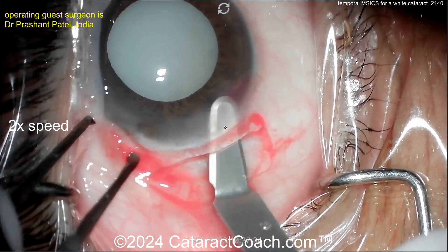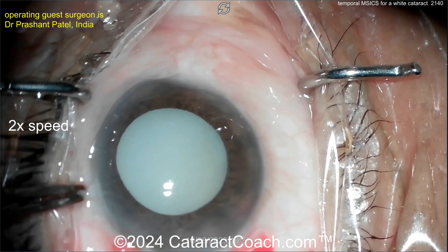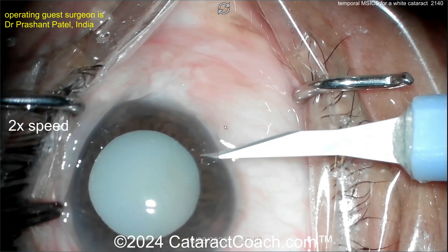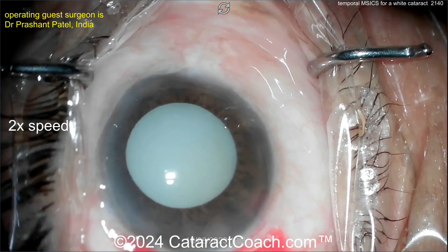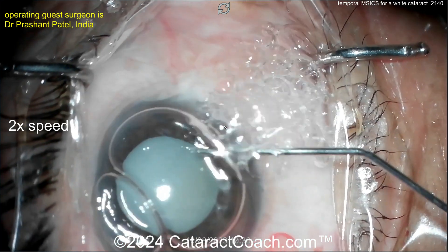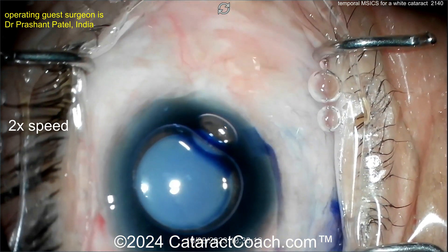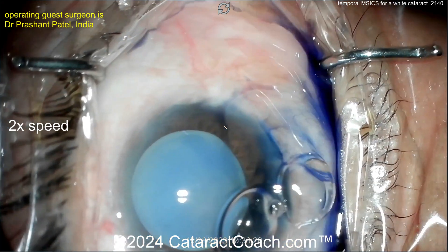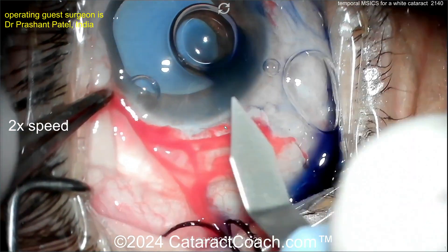Remember the wider incision is on the inside — it's a trapezoidal shape, wider on the inside and a little narrow on the outside. Nice trapezoidal shape. You're going to need some trypan blue dye to get a capsulorhexis done. Making a paracentesis here, a little wider than normal — that's going to be for a Simcoe cannula later. Now going ahead with the trypan blue dye inside the eye, a little air bubble too. That blue dye is going to give us good staining of the capsule.